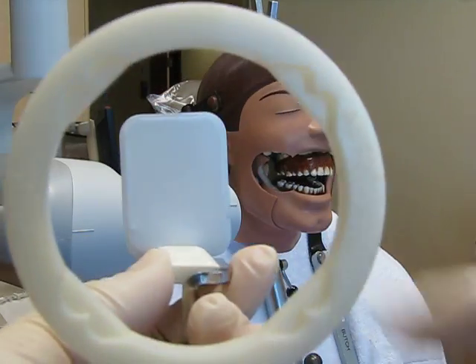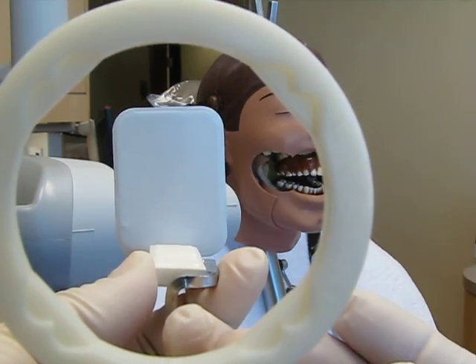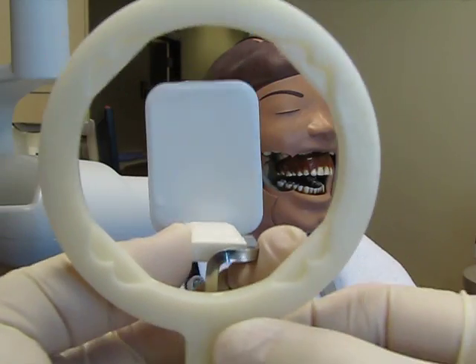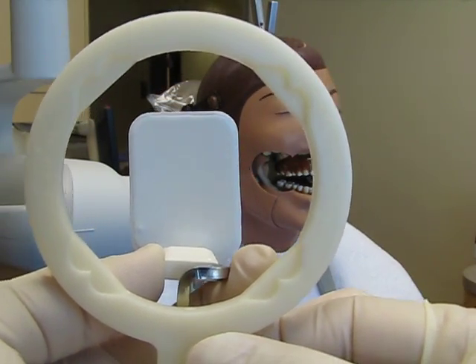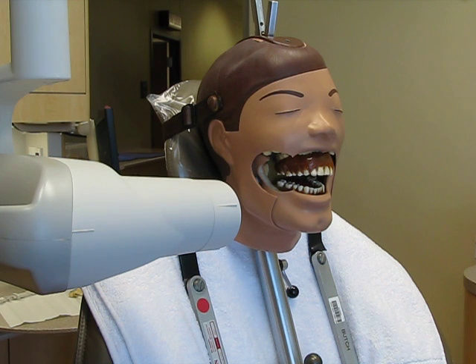You can see right through the ring, dot in the slot. The slot is what holds it, okay? And again, you test it to make sure you've placed it correctly, and it is, okay? So this would be an anterior one. I'm going to demo with a bite wing. Now with the anterior and the posterior, it always goes dot in the slot.